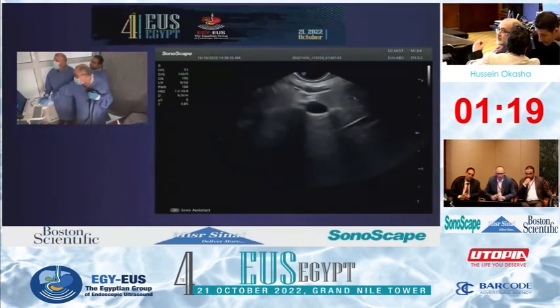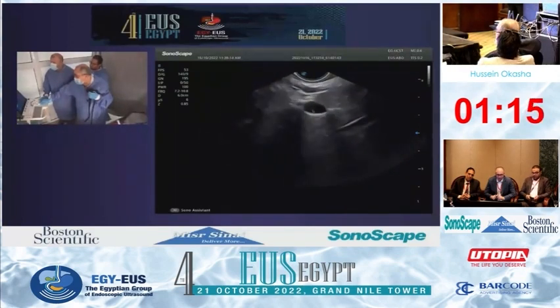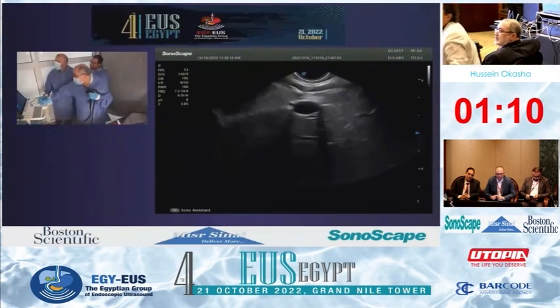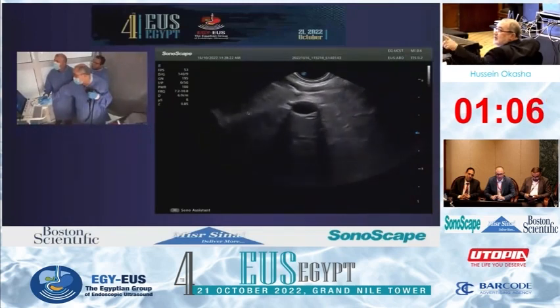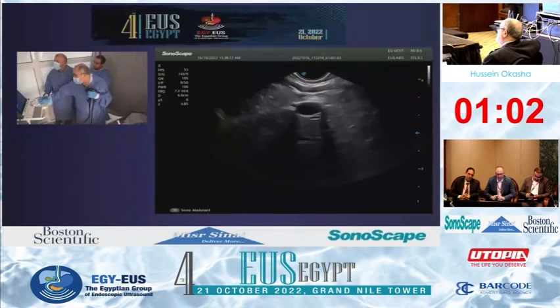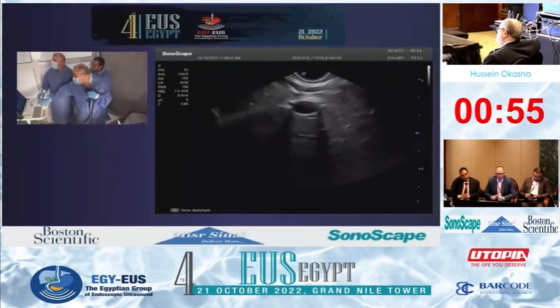And here can come segment 4. And this is the left portal vein. And here very nicely seen ligament to the right, which is the ligamentum venosum, going to the inferior vena cava, and ligamentum teres going to the inferior aspect of the liver, separating segment 3 from segment 4B. So this is segment 4B, and this is segment 3.